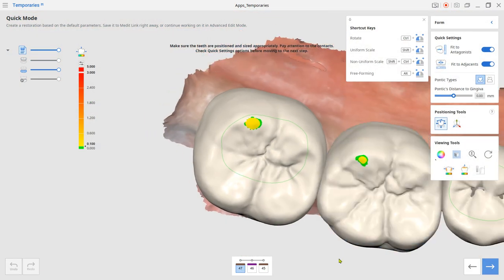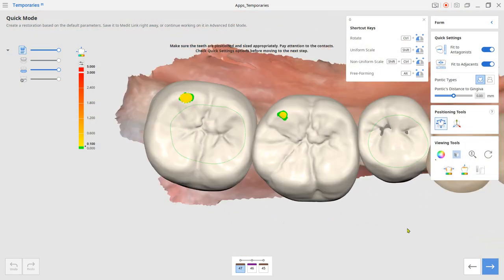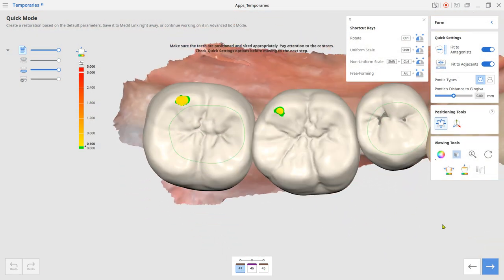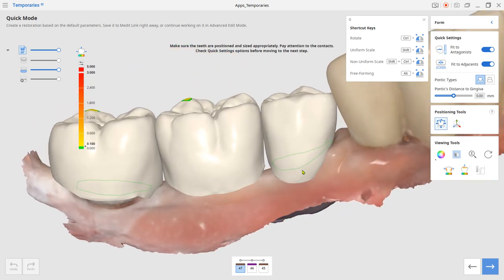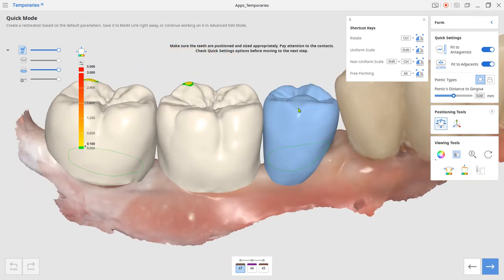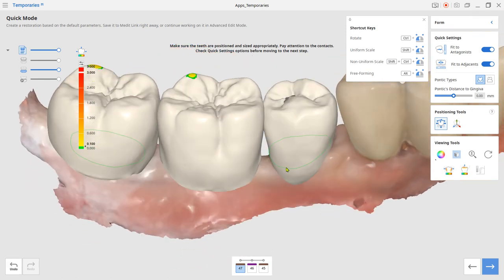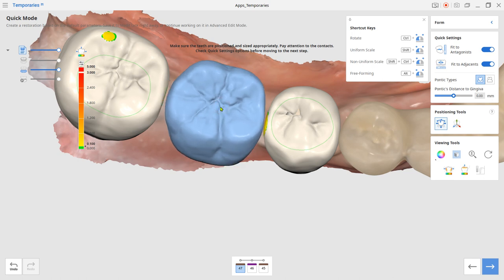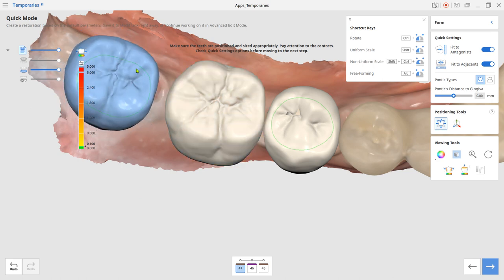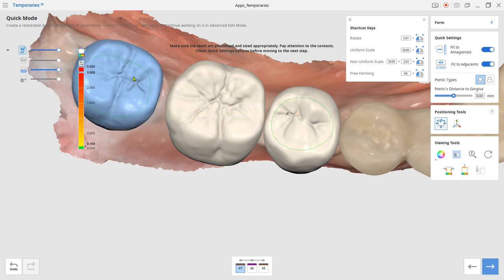Next, the system will generate the anatomic crowns from the library. Adjust the position and the size at this step. Use the shift key to scale. Use the control key to rotate.